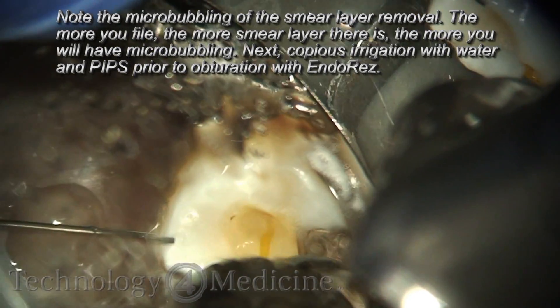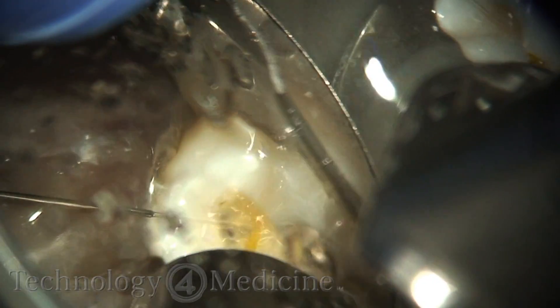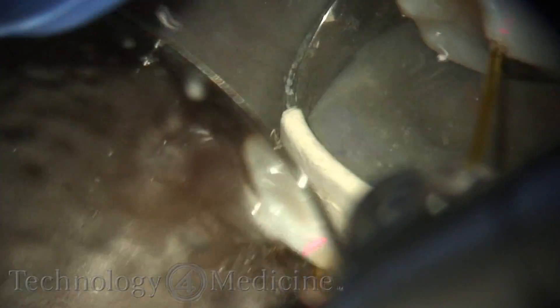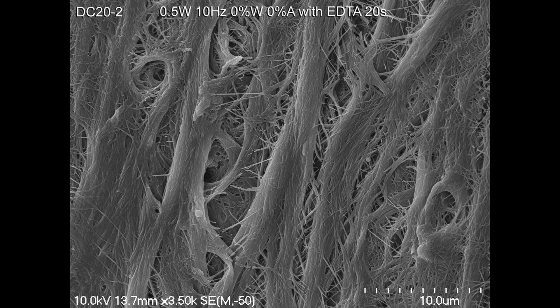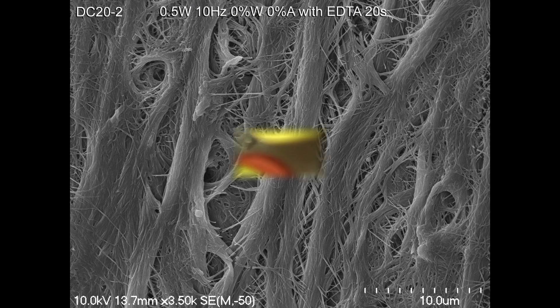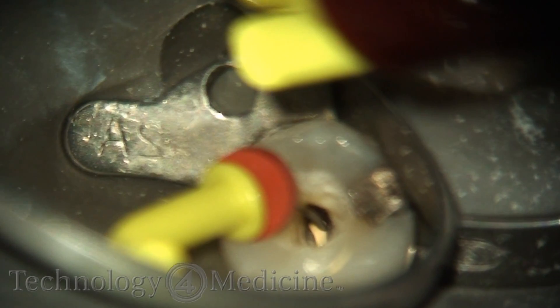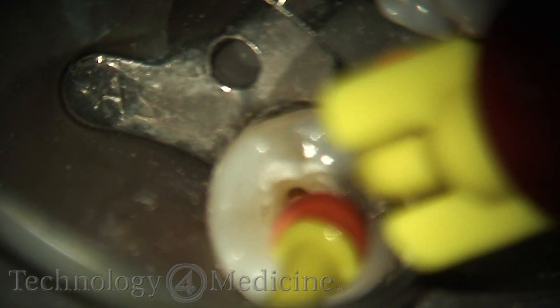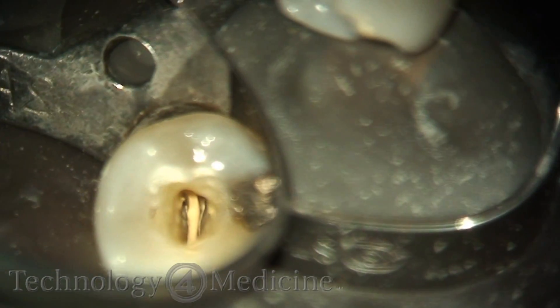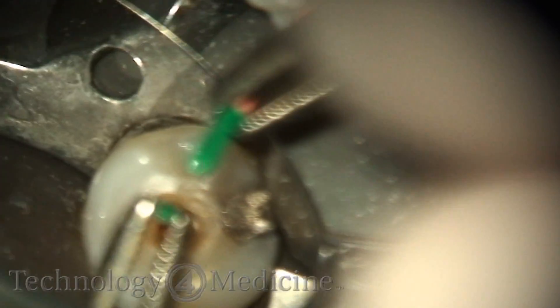Once the smear layer is removed, I'll use copious amounts of water and PIPS irrigation, utilizing the power of PIPS to finish cleansing the entire system in three dimensions. Our SEMs actually show very clean results. All these collagen fibrils are still in place because, again, it's not photothermal — there's very little temperature change. The collagen fibers remain intact. Then I use a resin, EndoRes from Ultradent, to obturate. Think of the resin tags among those collagen fibers and what a nice bond we achieve. PIPS — Photon Induced Photoacoustic Streaming — very easily done with the PowerLase AT.